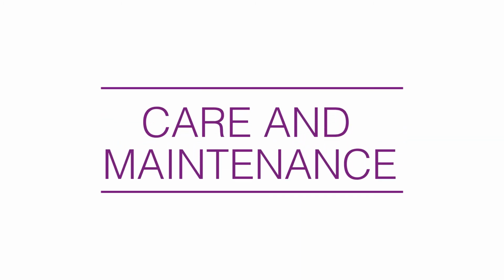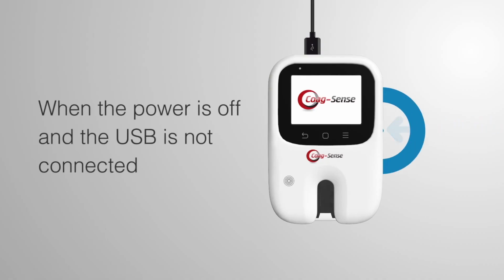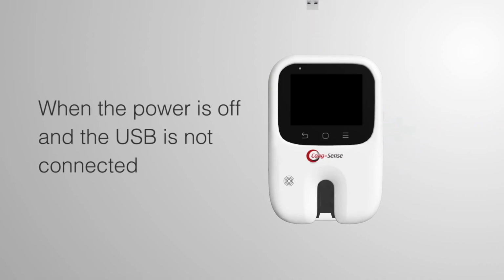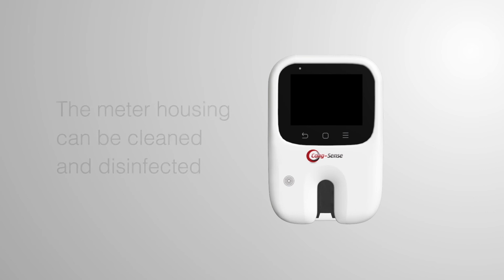Care and maintenance. No maintenance is required other than routine cleaning and/or disinfecting. When the power is off and the USB cable is not connected, the meter housing can be cleaned and disinfected.